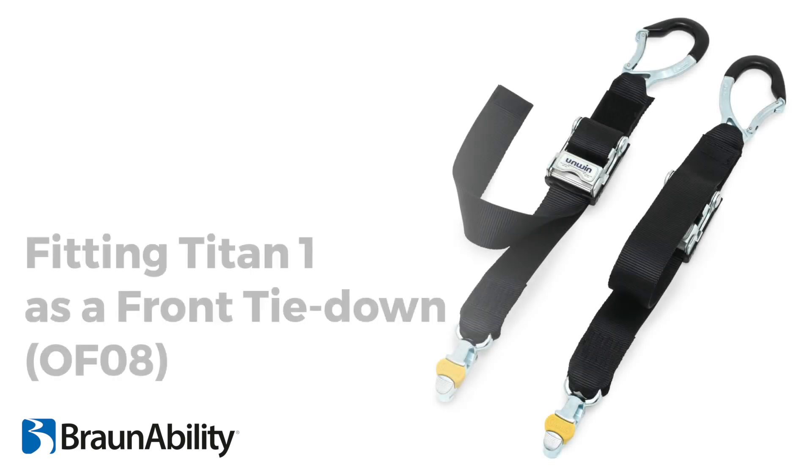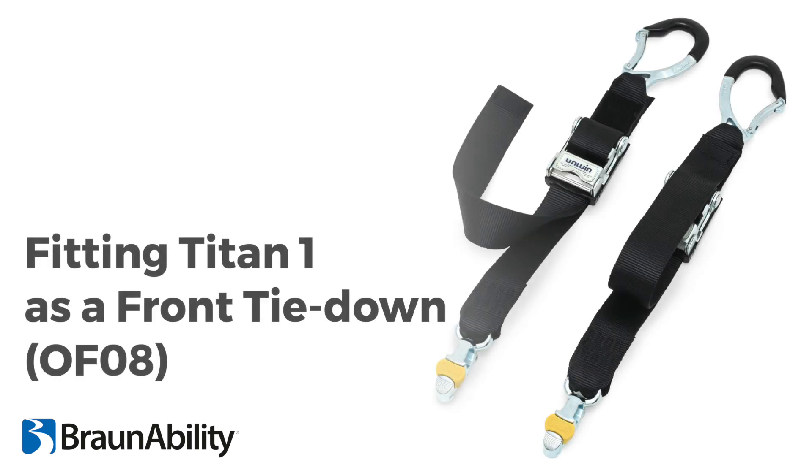Titan 1 is a generic six-point wheelchair tie-down solution designed to secure powered wheelchairs up to a maximum weight of 200 kilograms.